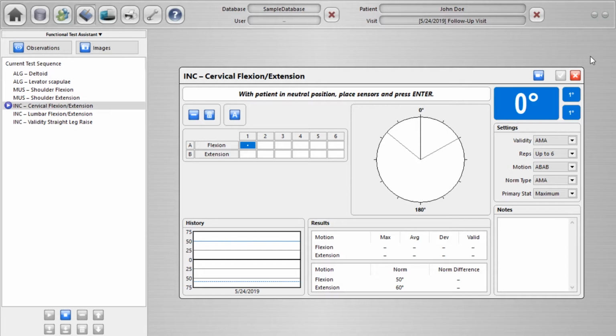So where you might look at the top of someone's head or the tip of their nose to try and find out, well, how is their mobility? By using a second inclinometer to capture any movement, any recruitment, or any involvement of joints lower down the spine, it actually captures that. So, for example, let's go ahead and place some inclinometers on a patient.